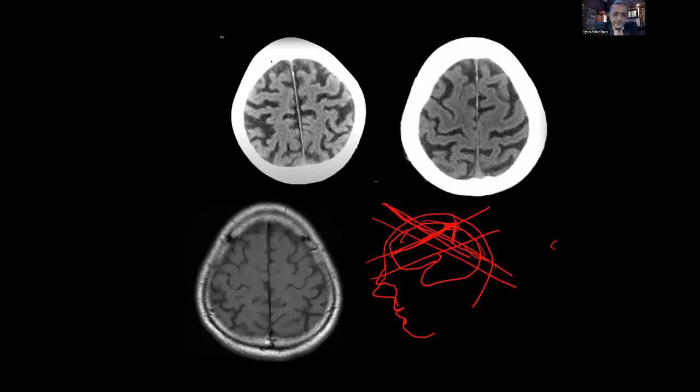So in here, for example, you see this again: the central sulcus, this knob sign, the precentral sulcus, the postcentral sulcus, which is dividing. See that? And this is the midline fissure. Whereas in the CT scan, the central sulcus is much anterior over here. This is the central sulcus, and there's this little knob over here, and this is that pars marginalis. So see, that's different. And again, this CT scan is tilted a little differently.